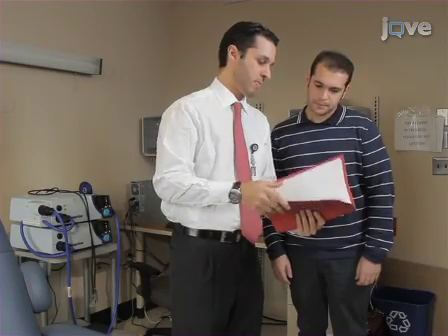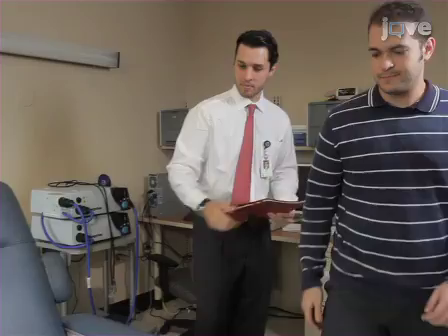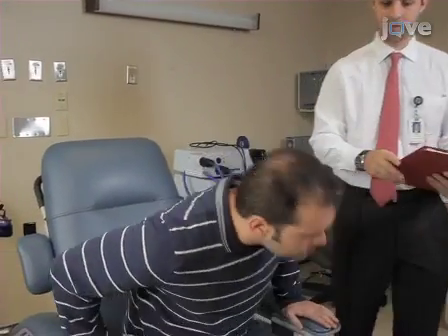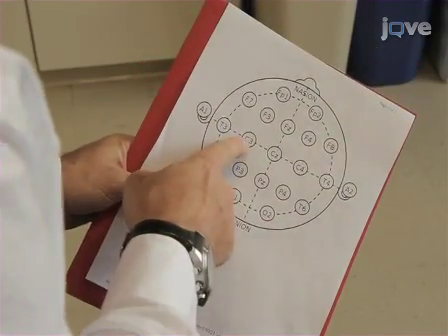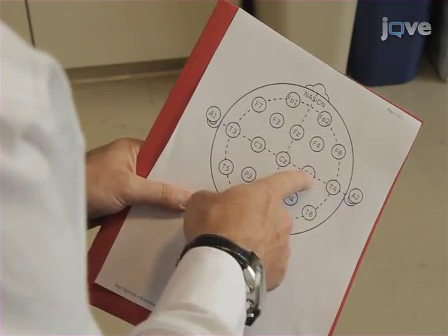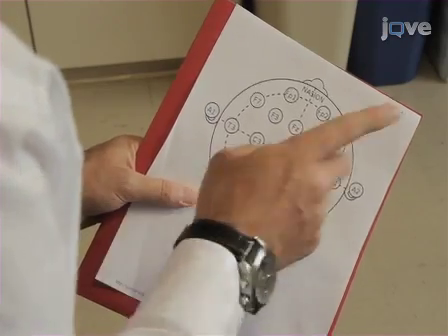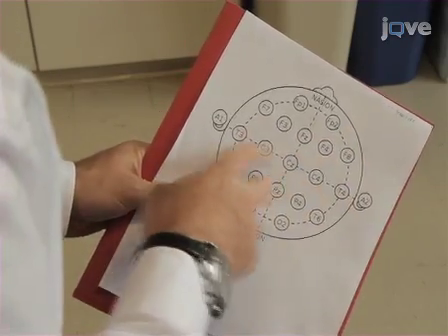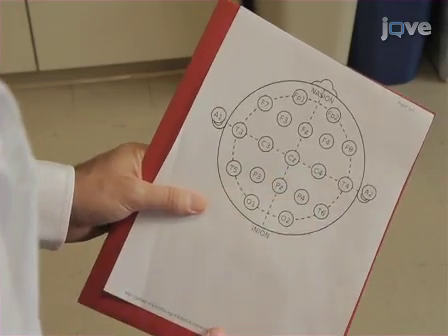When the subject arrives, have him or her sit comfortably in a chair to begin measurements for electrode placement. The stimulation location will be found by measuring distances on the scalp, usually using the convention of the EEG 10-20 system. Choose the site of stimulation depending on your experimental approach.